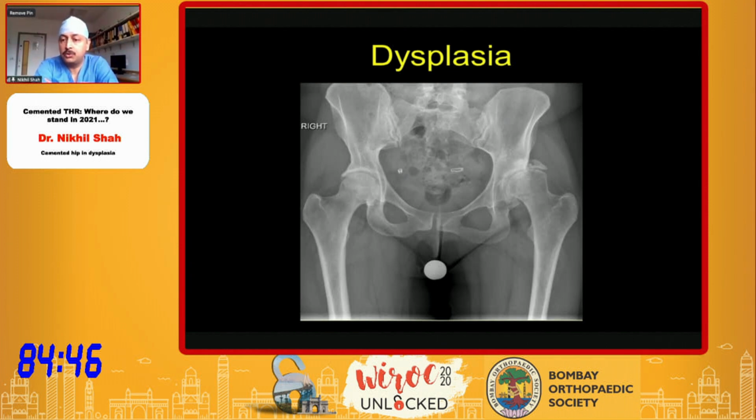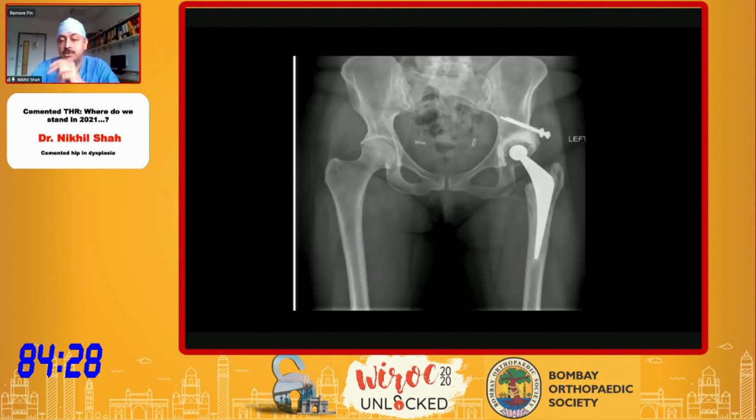So let's talk through the 3 levels of the Hartofilakidis type of cases. This case is probably the mildest variant, where your femoral head is nearly in the acetabulum. A lot of you might use an uncemented cup and leave the cup slightly uncovered superiorly, and that philosophy works quite well. My preference is to use a cemented cup and to try and get it nicely covered to restore the bone stock. Use a structural femoral head autograft and fix it with screws.